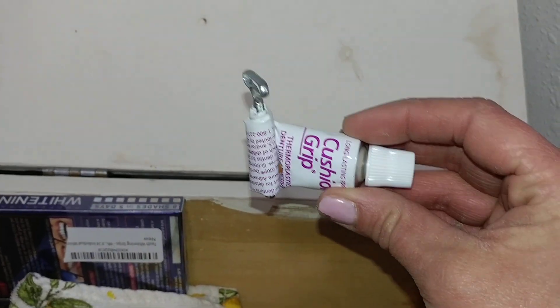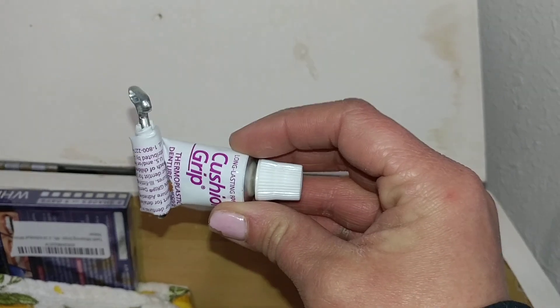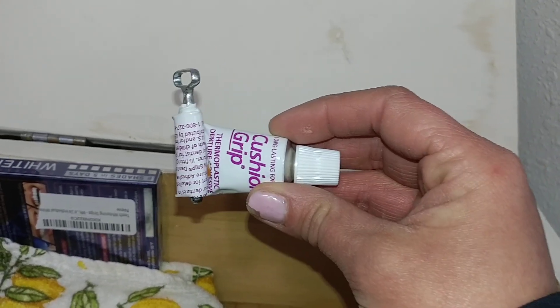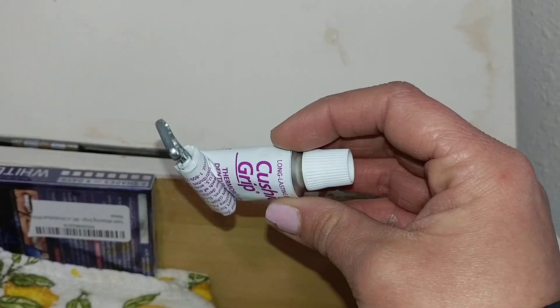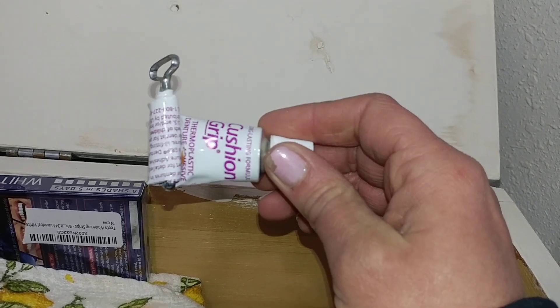The Cushion Grip — obviously I've been using it. This was a huge deal for me when I couldn't get to the dentist and I needed a reline. This was really nice to already have on hand and not have to wait around for Amazon to ship. I've never seen this in a store — I've looked everywhere — Amazon is where I bought it and that's really helpful.